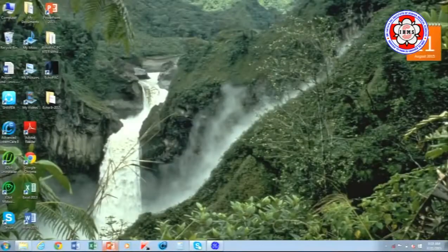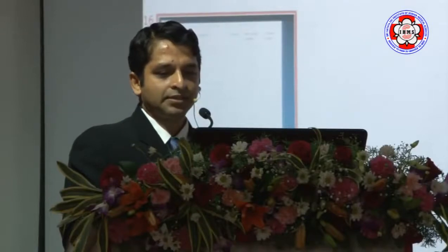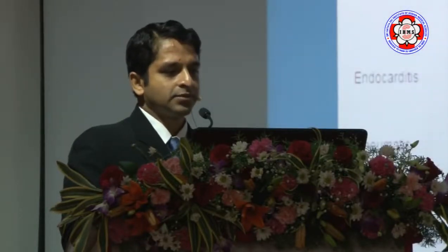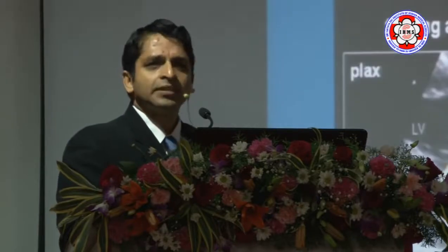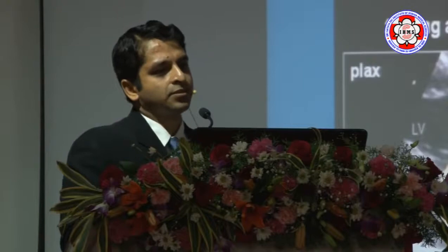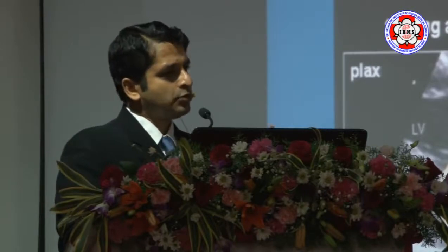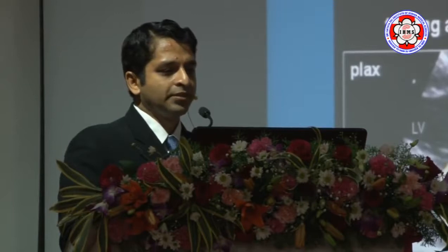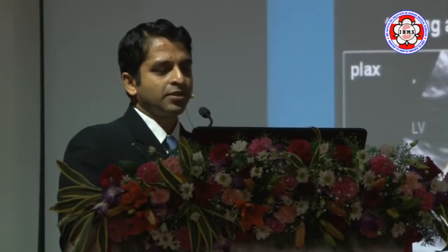So we can use TE very well to tell you what's happening, but we have to put it into context of all the other variables that we measure. So yeah, we look at things like the annulus, the chordae, the papillary muscles, and so forth. And there's some new things that have also come out, and that's what's shown on this slide. For functional mitral regurgitation, there are some newer measurements that have come out. There's 6 of them shown here, but actually there's probably just a few that are really useful.